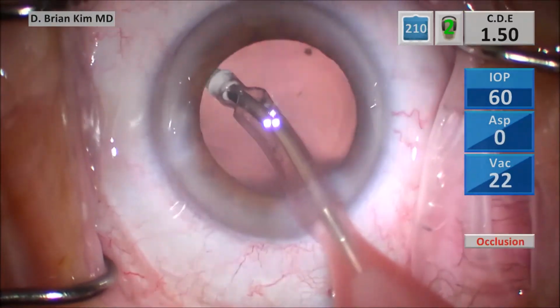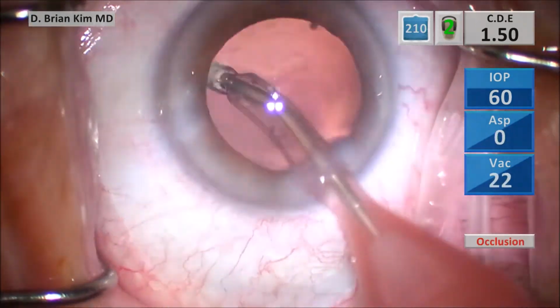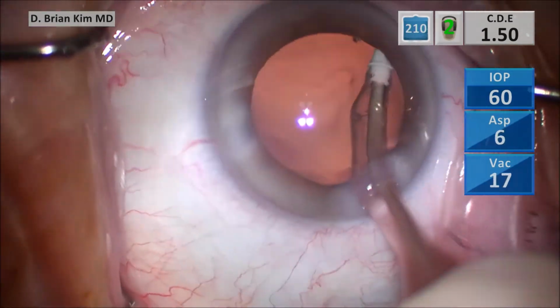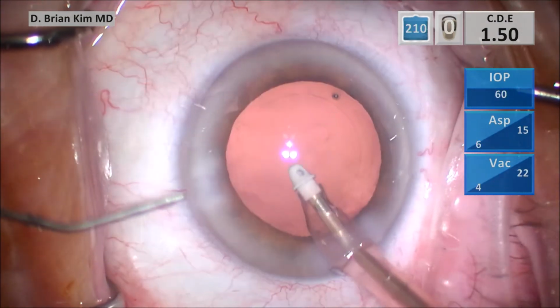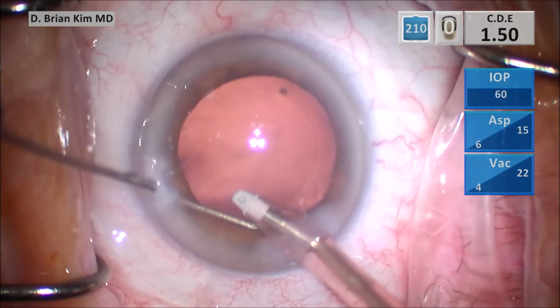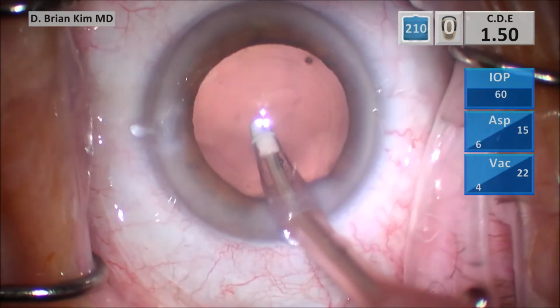I think there's some stubborn pieces of lens material on the bag in that corner, so I'm just trying to make sure I get it all. Sometimes with these dense lenses, you have fibrous material that's adherent to the bag. It's hard to get that out. You just leave it. So I'm using the cannula to pulse the subincisional space. Looks pretty clean.